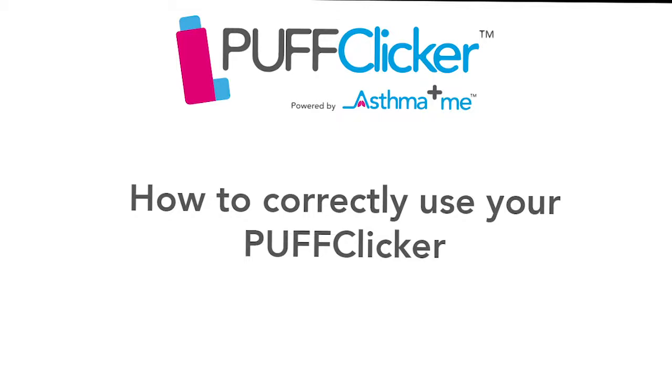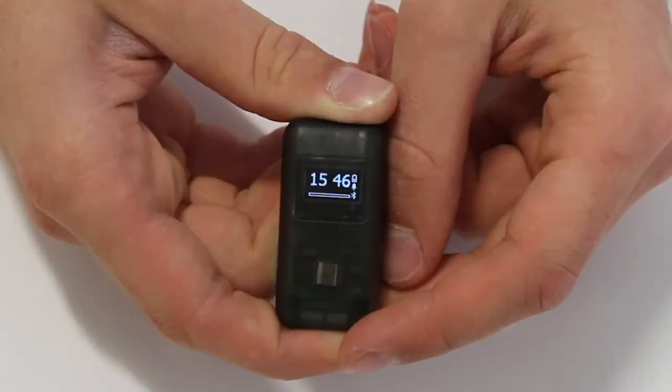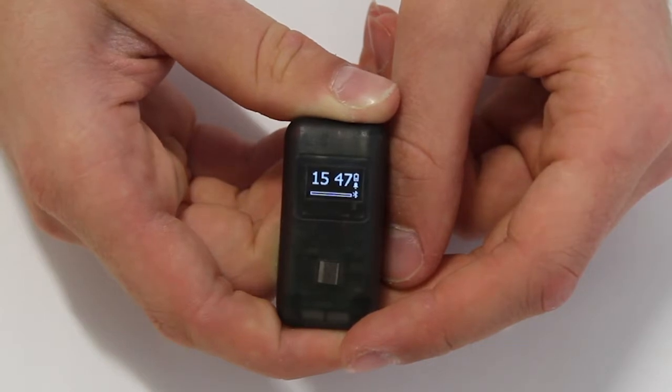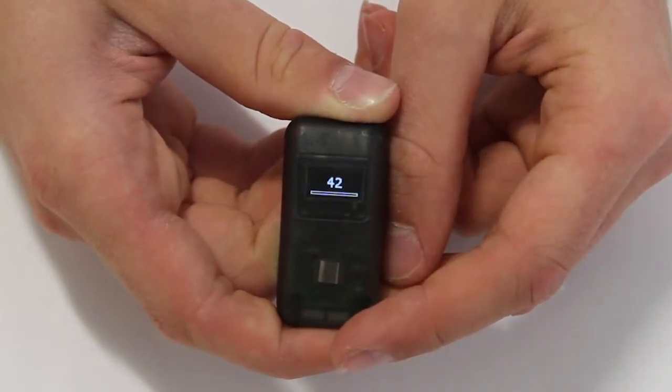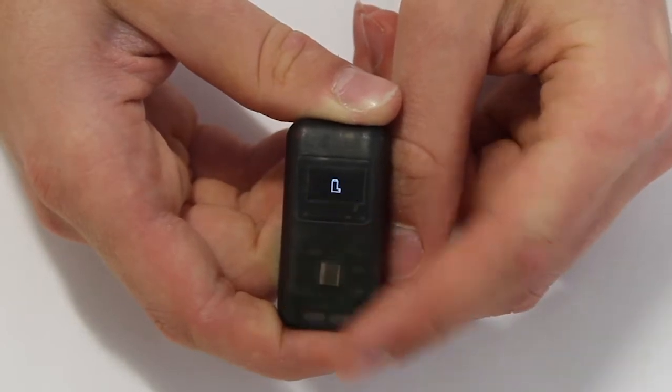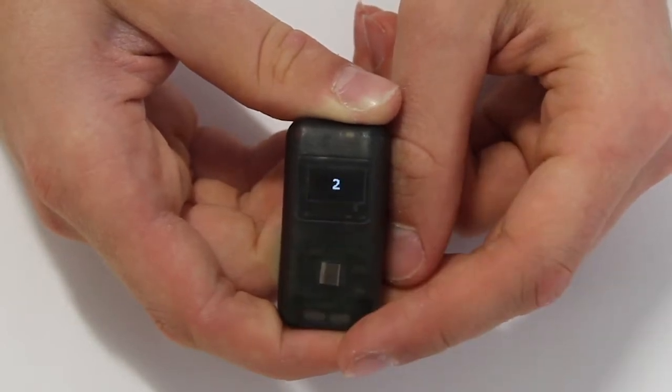To use your puff clicker correctly, you need to know that there are four screens: the clock screen, the steps if enabled, doses of inhaler, and the battery symbol.